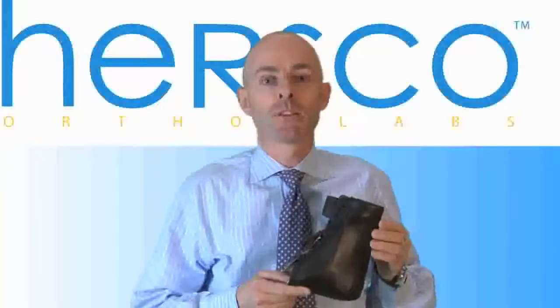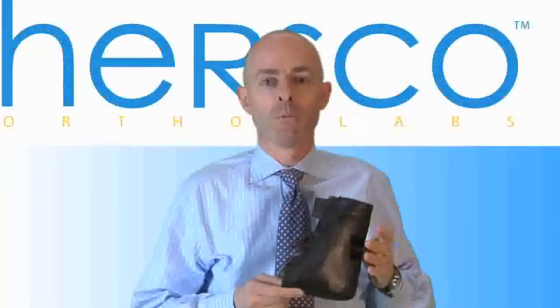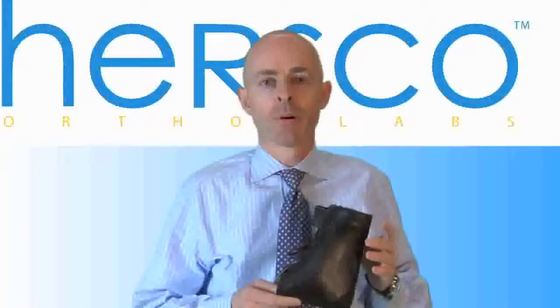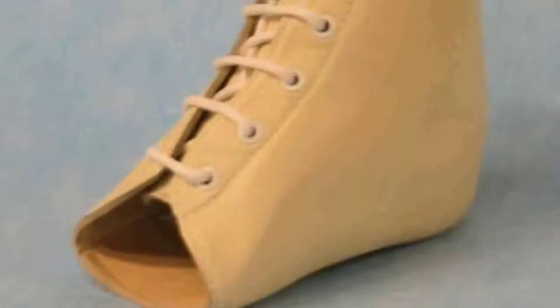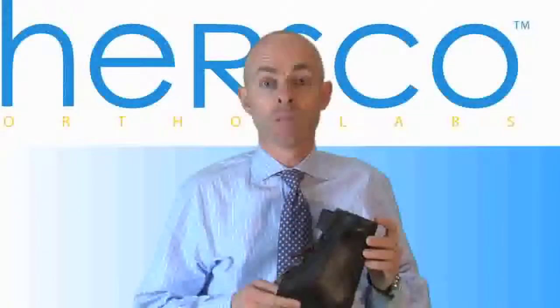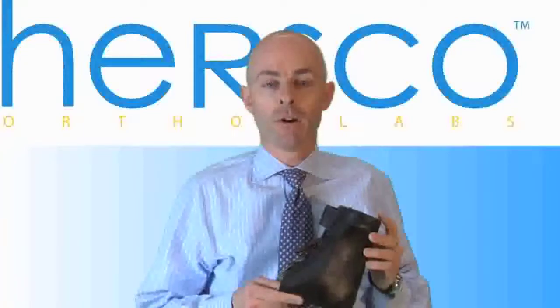Historically, these braces were made from molding leather, which were molded over the ankle and the lower leg, and then they were finished with upper or outer leather and a lining leather, and they were used to control motion of the ankle. More recently, thermoplastics have been used as the basis for the control of this AFO.